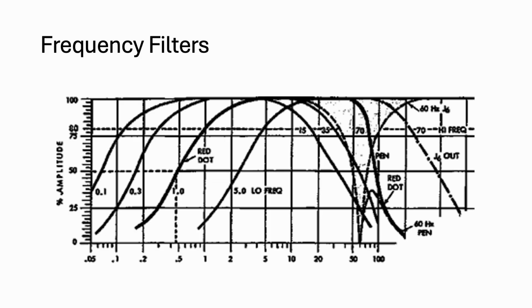This is a frequency response curve. We'll have a whole part on this. By setting the low frequency filter or the high frequency filter cutoff frequencies, which are the numbers you're setting, we choose the window or the frequency band that we are interested in viewing. This is a filter response curve. It describes the frequencies that the majority of the recording will show. These filters do not cut off all frequencies. It's a gradual cutoff that reduces logarithmically.